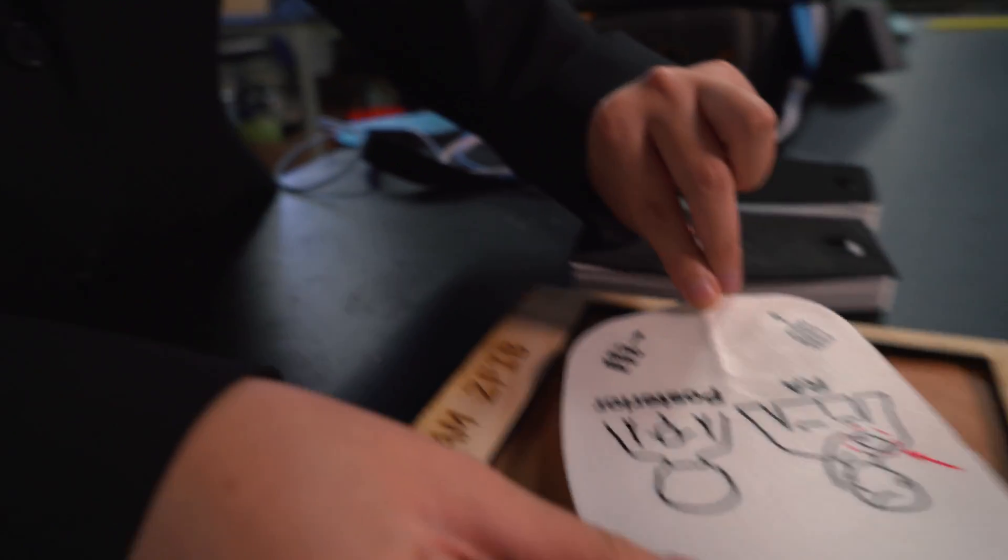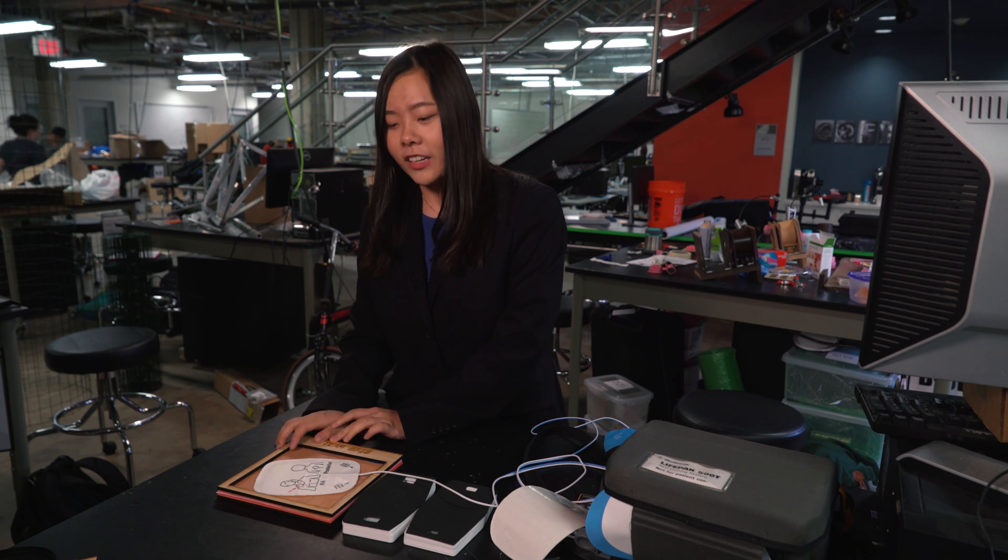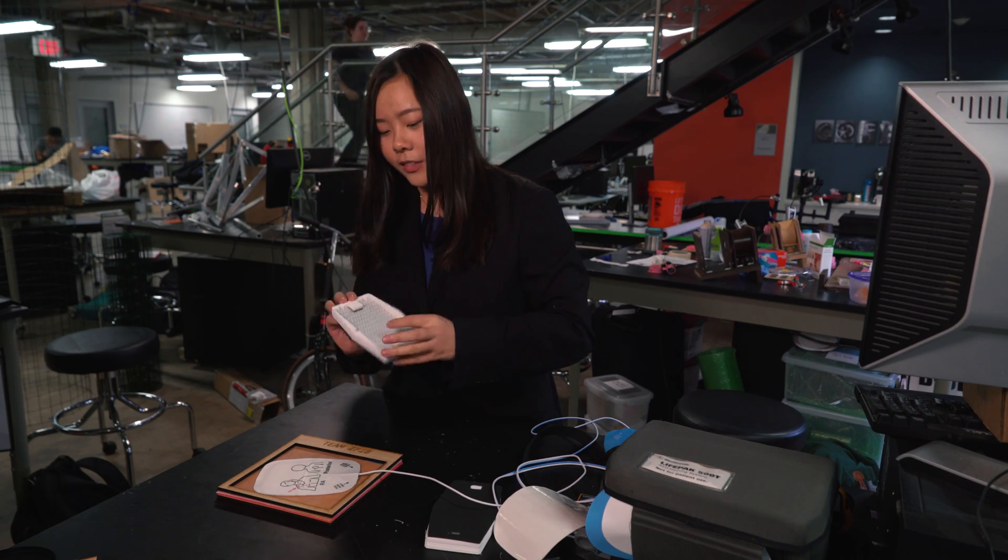We press it onto the skin and then try to defibrillate. If unfortunately this doesn't work, that means maybe the skin impedance barrier is too high for this patient, and then we can use our prototype.